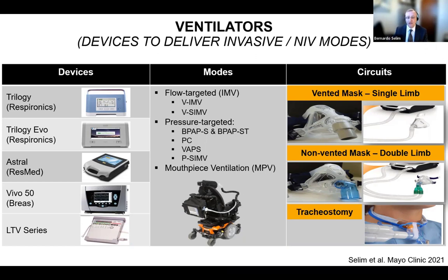Therefore, their pressures are much higher. So sometimes you need to understand what you need in order to know which box is going to be delivering these modes, because most of the modes are shared by these two groups of devices.